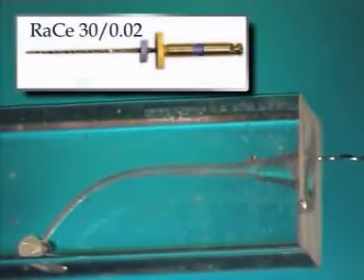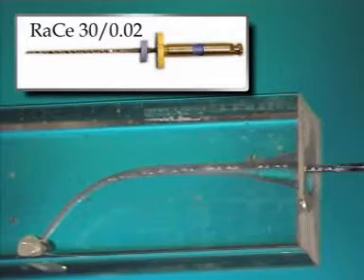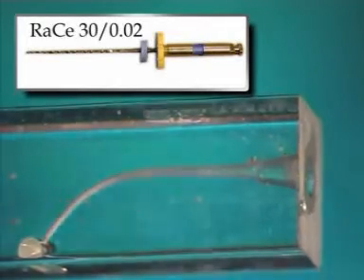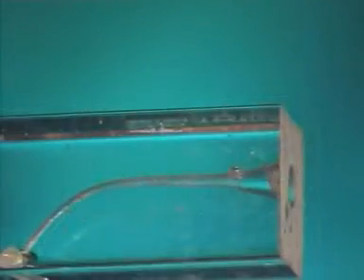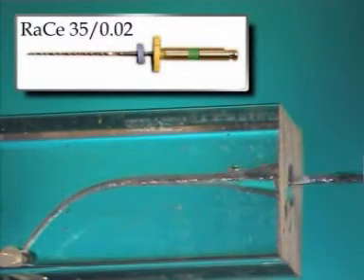3002 to working length. Instrument 3502 to working length as well.